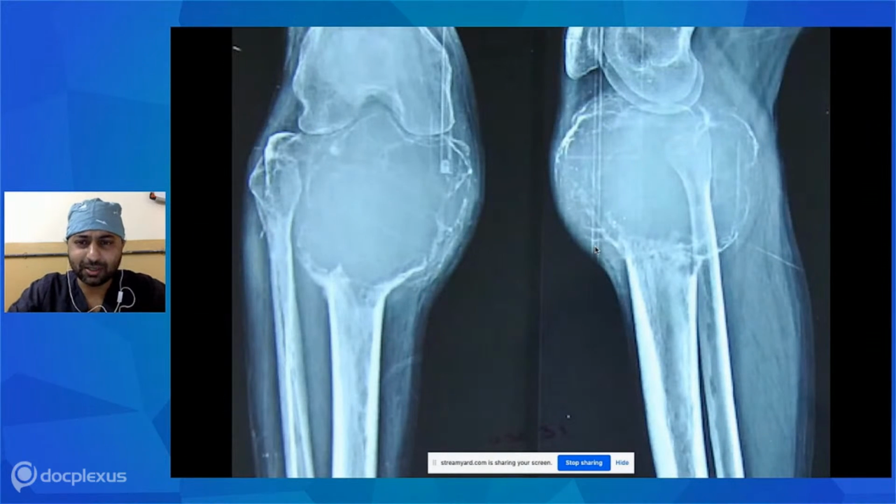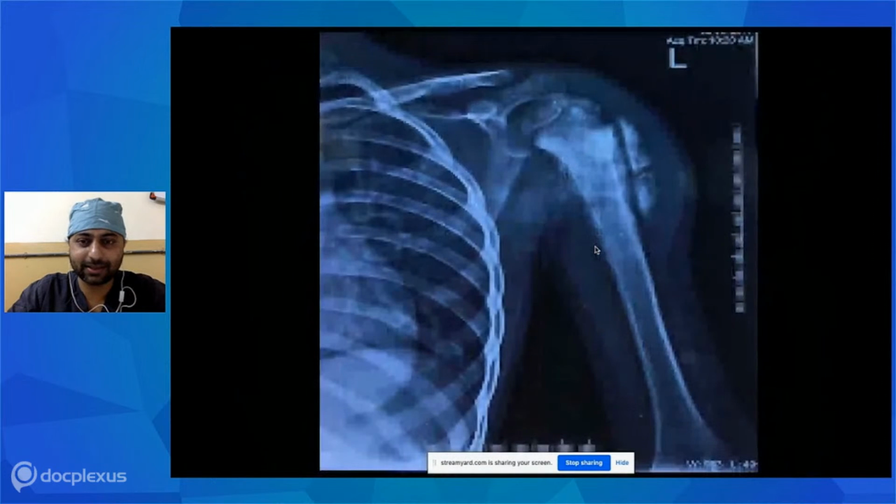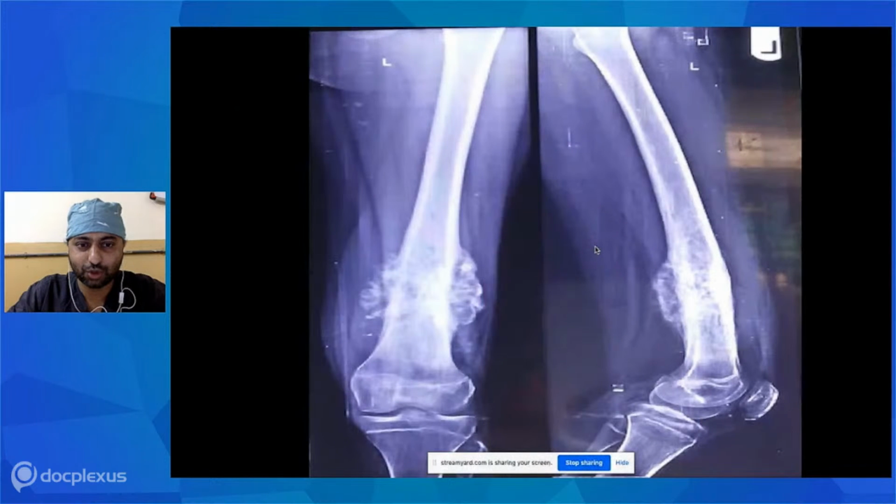Third example, quite a big lesion involving the tibia. Again, osteolytic, well defined, no periosteal reaction, so most probably a benign bone tumor. So again, MRI was done. It was a giant cell tumor of the tibia. Fourth example, same as the X-ray which we have seen a few slides before. Last X-ray, again a lesion, skeletally immature, soft tissue mass present, ill-defined, involving the diaphysis and metaphysis, with periosteal reaction. For this patient, we did an MRI. It was osteosarcoma and was treated with neoadjuvant chemotherapy.